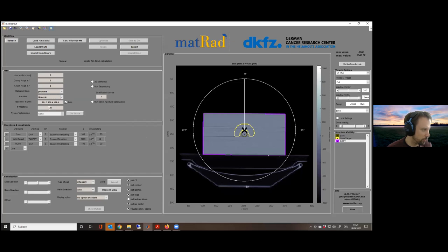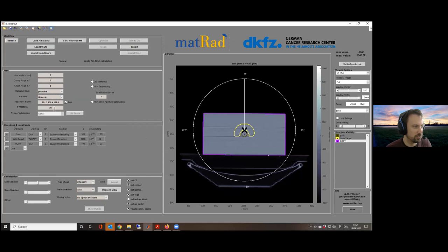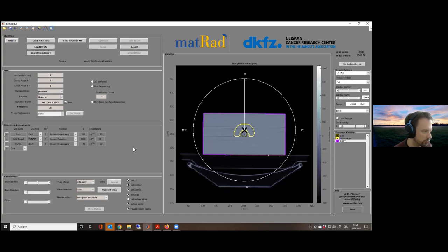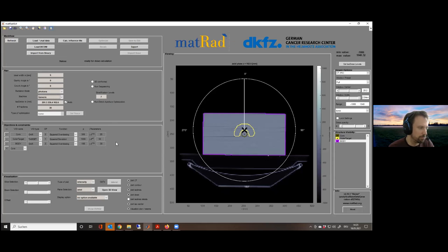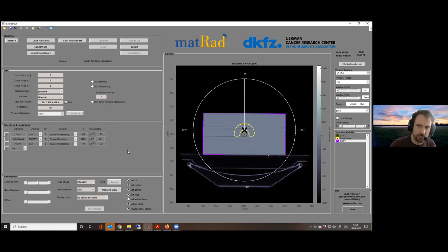You usually don't need to touch the isocenter — matRad determines the center of mass of the target and computes it automatically. The last parameter is the number of fractions — how many repeated fractions the patient comes in for treatment. We will stick with 30. That is a normal number, though treatments can also combine, for example, 20 photon fractions and 10 proton fractions.